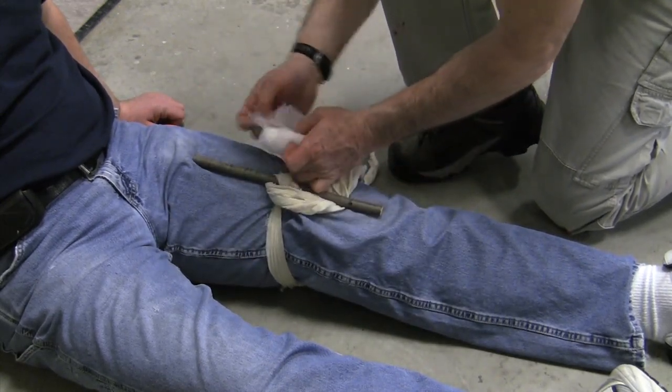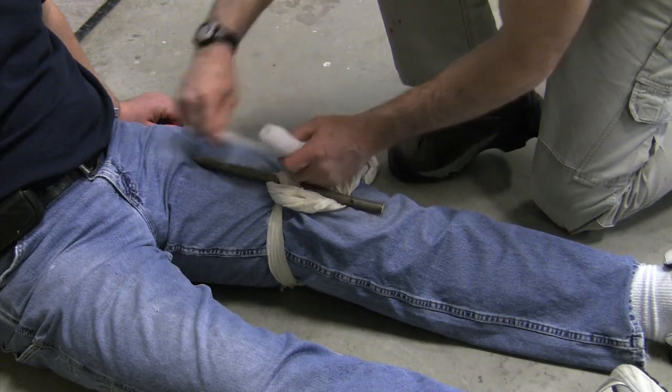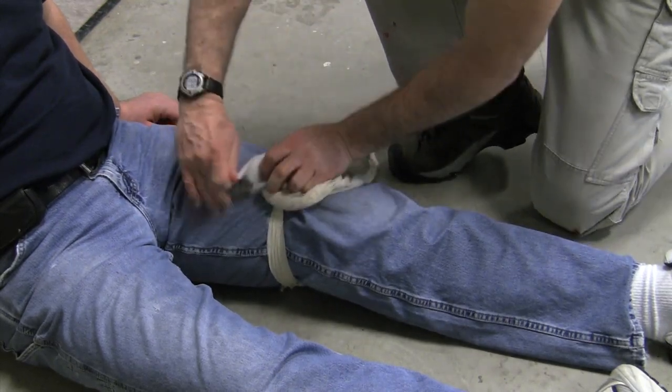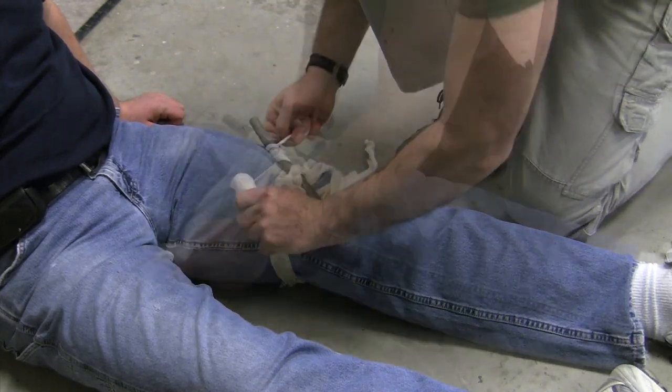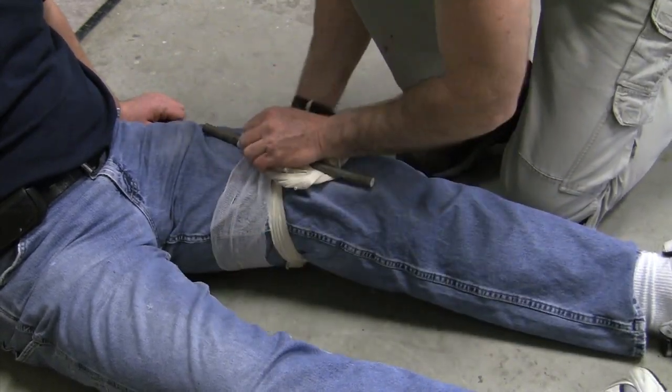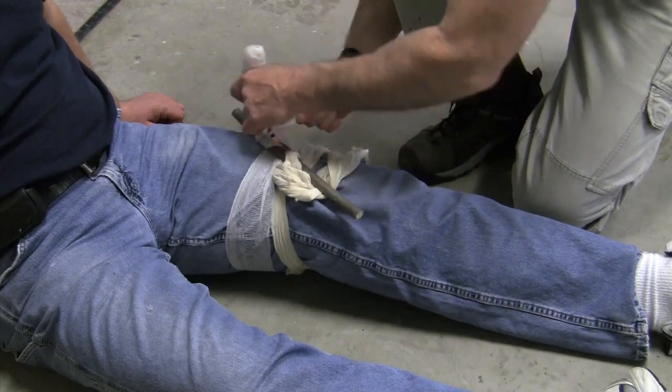Now we will secure the windlass. Today we will be using a roll of gauze. Wrap the gauze around the windlass and the leg, securing the windlass in place. Remember to record the time of application.